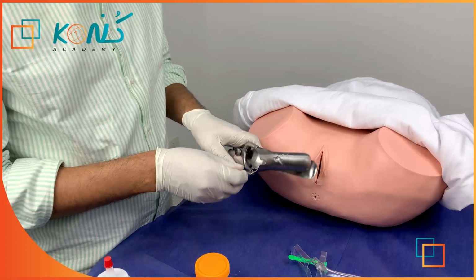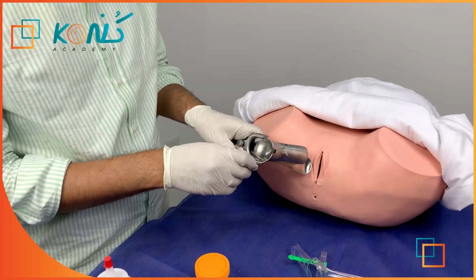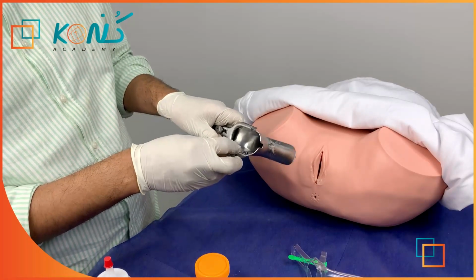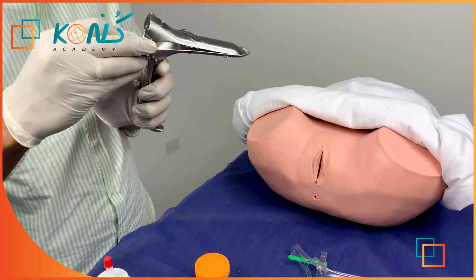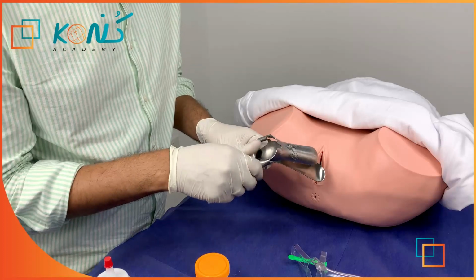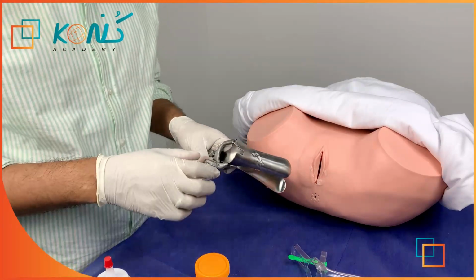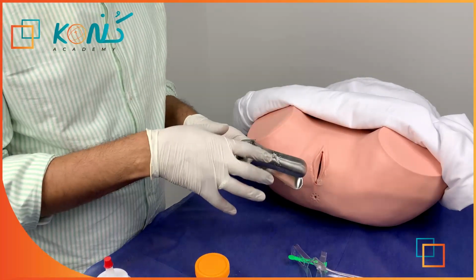So the trick here is that while I am taking the speculum out, I shouldn't close it until I have withdrawn it for some inches. We can make it half closure after this until we are about to take it out. We will close it only when we are about to take it out. Why didn't we close it while we are in? If you close this speculum while you are still in, this could cause traction on the cervix. It will be severely painful. So we are trying to avoid closing the speculum while we are in.